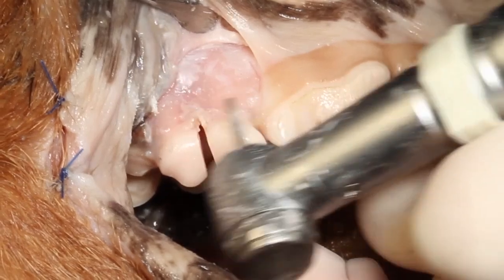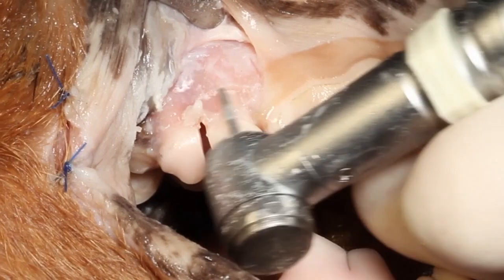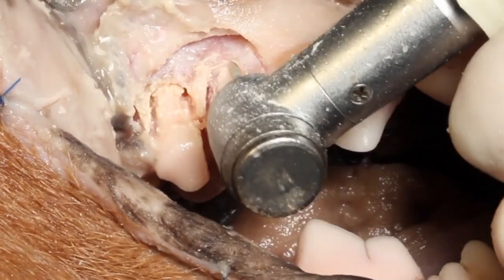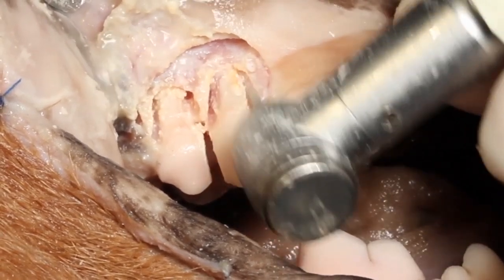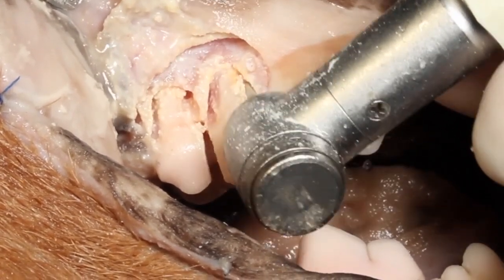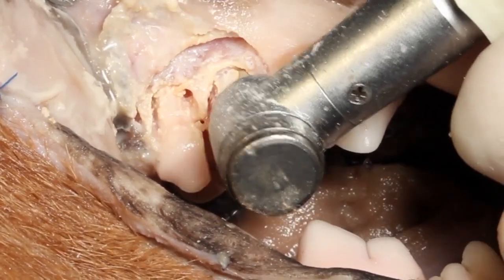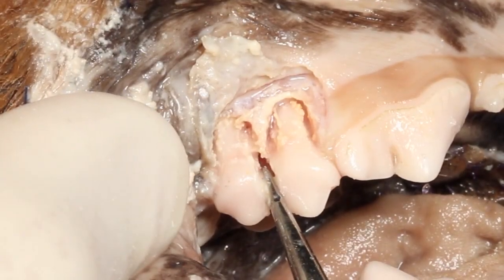Now back to the exposure — what we're going to do is remove the vestibular bone on these roots to expose the tooth roots and then create grooves on either side. This allows us to place our luxator and also decreases the volume of bone surrounding those tooth roots. You can see we're actually making a little ledge up underneath the apical portion of that root to aid in extraction.